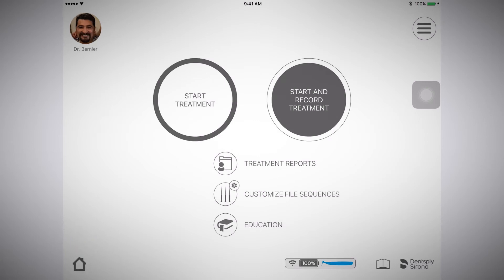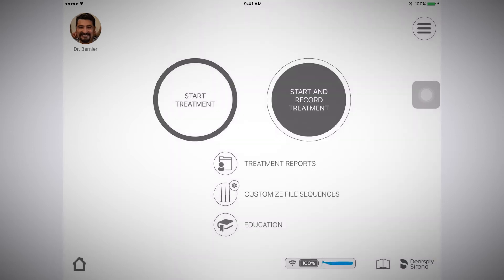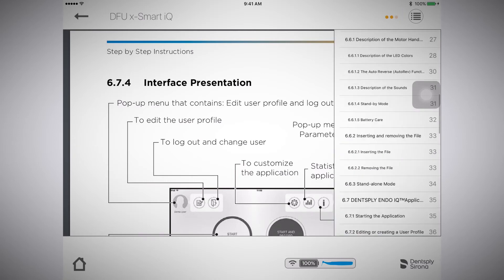You will always be able to return to the screen by pushing that button. The blue icon of a motor handpiece shows that you are connected. The battery icon shows the percentage of battery remaining for the motor handpiece. When selecting the book icon, the digital directions for use will appear. To make your searching easier, you can select the table of contents through the menu icon.